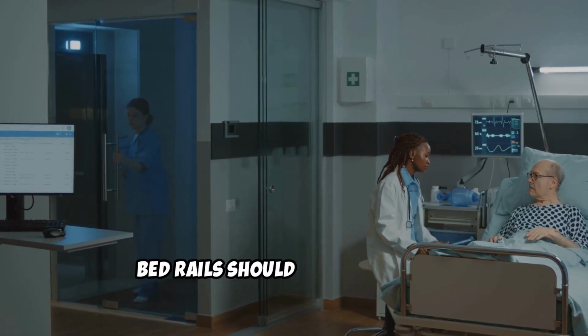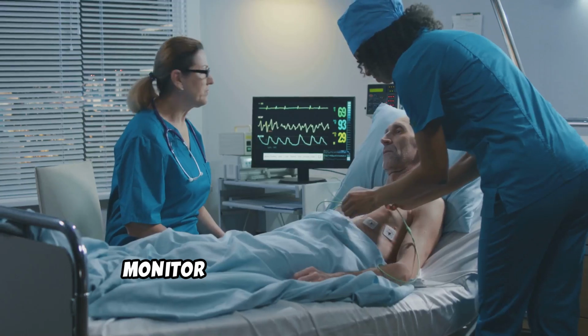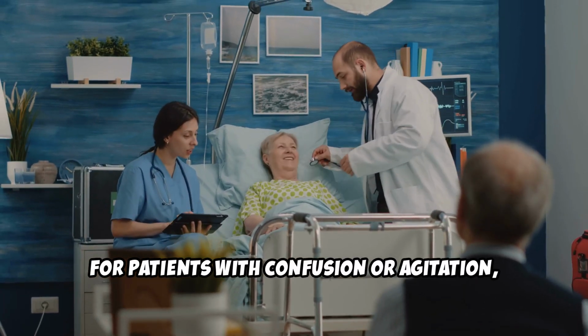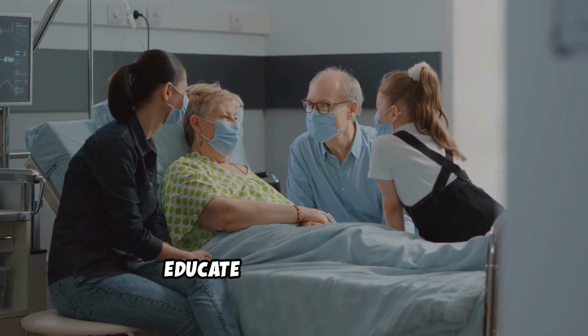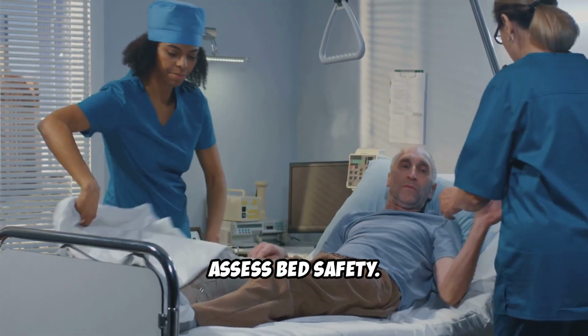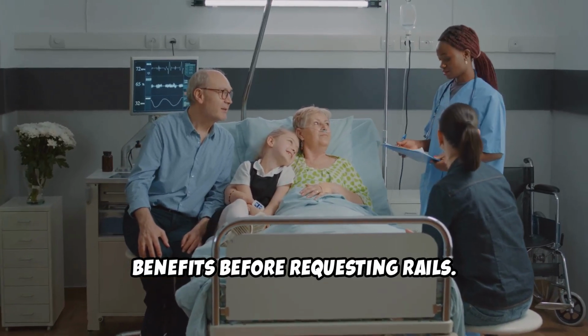Remember, bed rails should not be used as a restraint unless ordered and documented. Monitor high-risk patients closely. For patients with confusion or agitation, side rails may increase injury risk. Reassess daily and involve the care team in decision-making. Educate staff and families. Ensure all team members know how to assess bed safety. Families should understand risks and benefits before requesting rails.